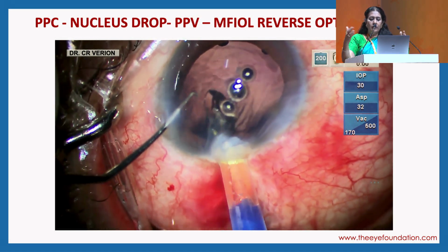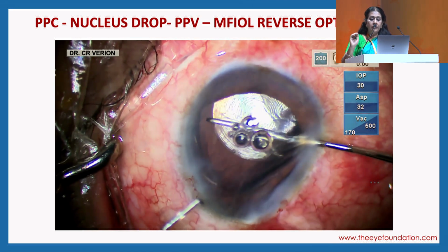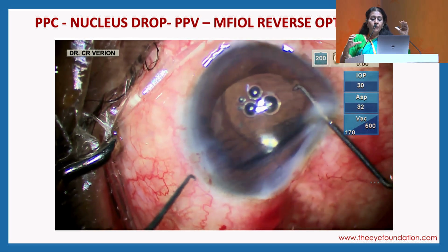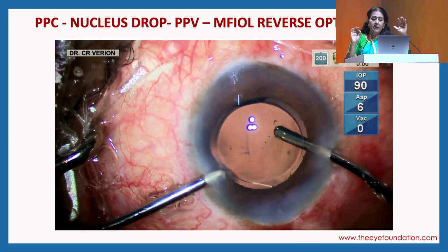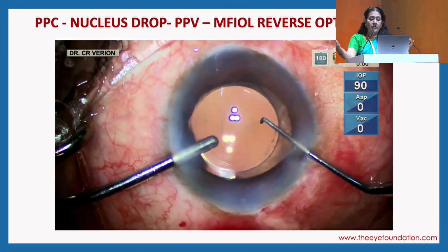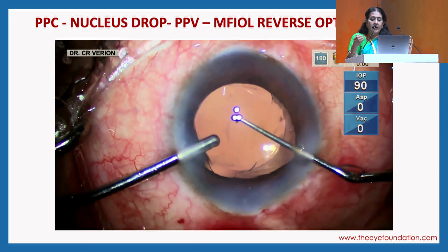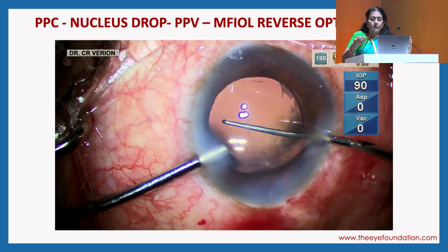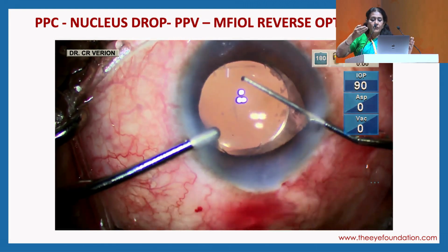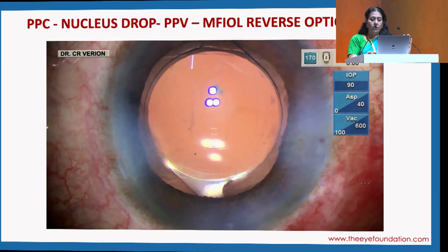I take it to get the retina surgeon to remove it, then bring it back, and then here, there is adequate posterior capsule superiorly, inferiorly. So I inject my premium IOL, multifocal IOL, into the capsular bag. There's a central rip of the PC. So once I position the haptic in the capsular bag, I just nudge the optic up onto the rhexis, which is what you call a reverse optic capture, and then secure the wound.